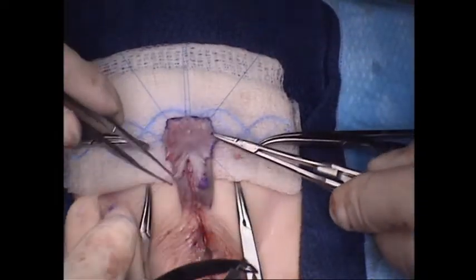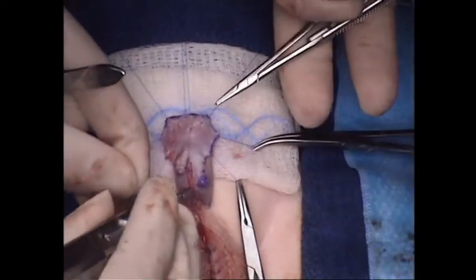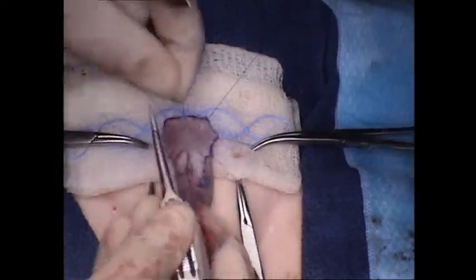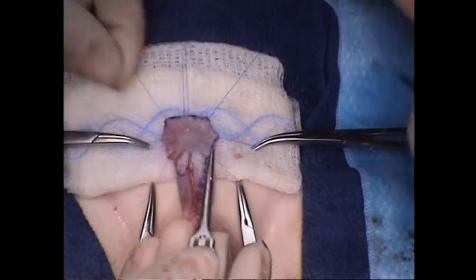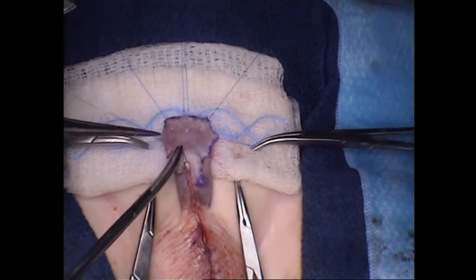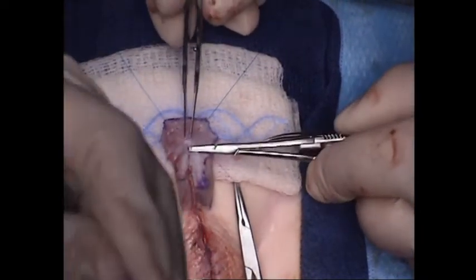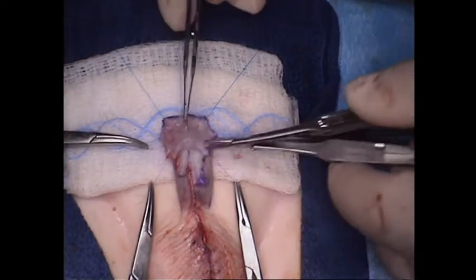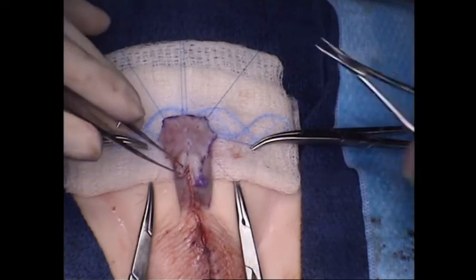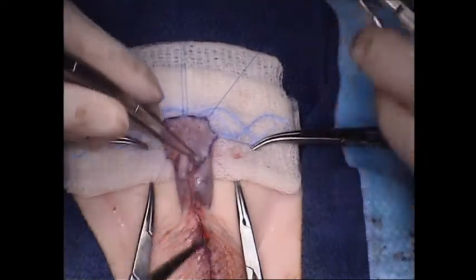So some people talk about pie crusting, making little holes in the graft instead of quilting the graft. We don't do that because those holes will close up very quickly, usually within a couple of days, and while it's still getting its vascularity from below, and if there's any collection of blood or seroma underneath the graft between the corpora and the graft, you will have partial or complete loss of your graft. So we really want this to be fixed to the corpora. Again, that kind of concept of a backup system, as we discussed earlier.